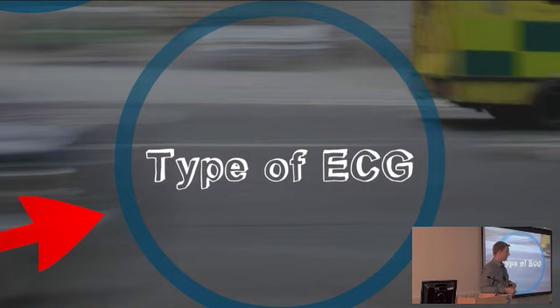And there are only 3 landmarks I could possibly think of that you might put them on going around the back. The first one, as you're going around for V7, is the posterior axillary line. So you're going to stick V7 there. V8 is the next landmark, and that's the tip of the scapula. And then the only next landmark you're going to get is the edge of the vertebrae, and that's where you put V9. So there are 3 landmarks on the surface. You stick a lead on each of them in the same horizontal line as V6, and it's that simple. V7 to V9 are posterior leads. And then you have a 15-lead ECG.